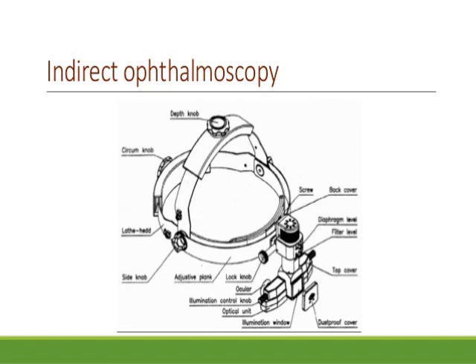The examiner moves around the head of the patient to examine all the different quadrants of the fundus. He or she will stand opposite the clock hour position to be examined. That is, to examine the inferior quadrant, the examiner has to stand towards the patient's head end, that is the six o'clock meridian. And also, the patient can be asked to look at extreme gazes, and by using a scleral indenter, even the whole peripheral retina up to the ora serrata can also be examined. The application is that it is used for assessment and management of retinal detachment and other more peripheral retinal lesions.